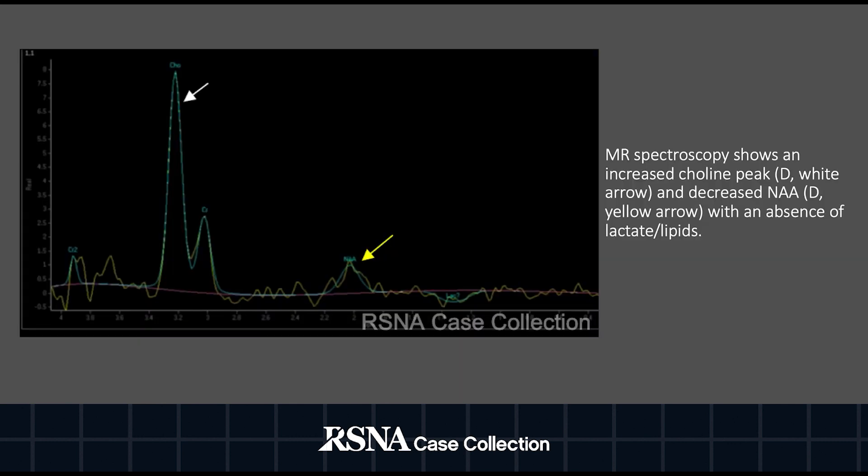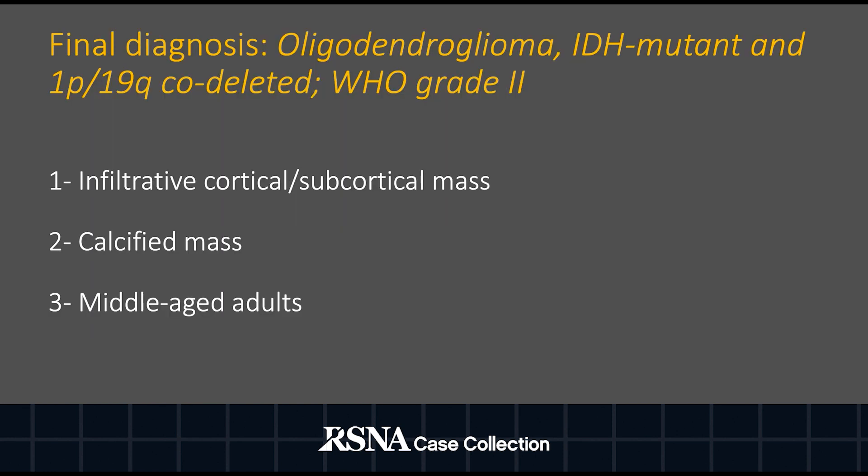MR spectroscopy shows an increase of the choline peak depicted by the white arrow and decreased NAA depicted by the yellow arrow, in keeping with an abnormal increased choline-to-NAA ratio.